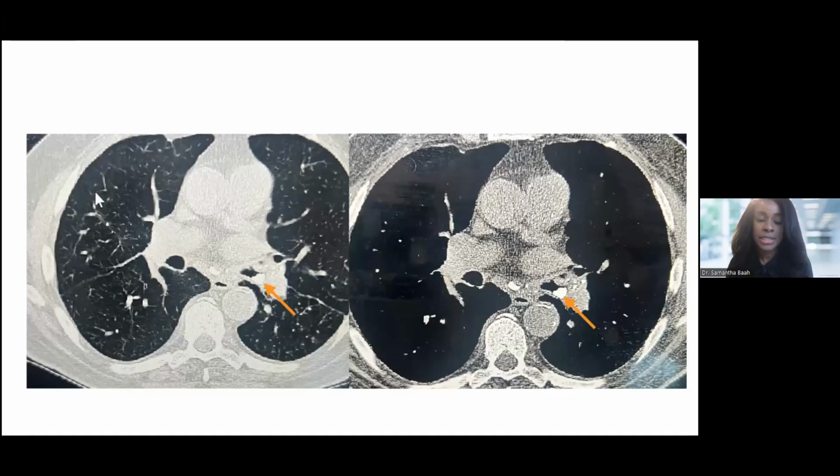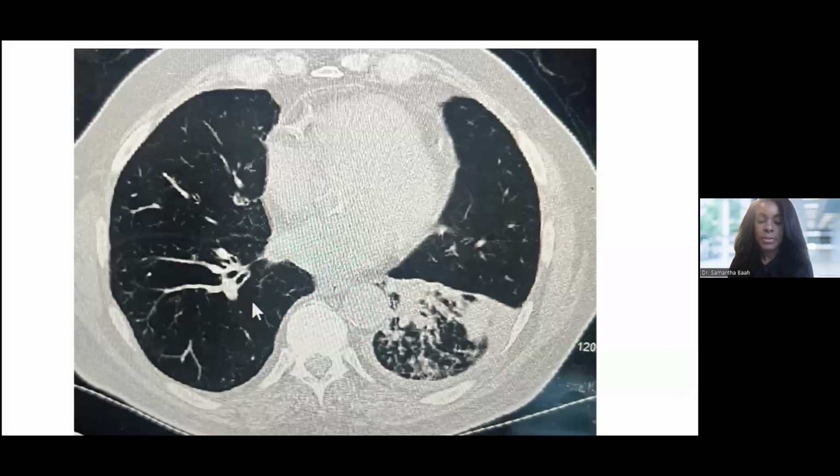And this was his CT scan. As you can see here, you have this calcified structure in the airway where the arrow is, and on the mediastinal windows, you can see it there. It's the same color as the bone. And when you track down his left lower lung, you find that he has pneumonia there. So he has a lesion that looks calcified in his airway, and he has post-obstructive pneumonia.